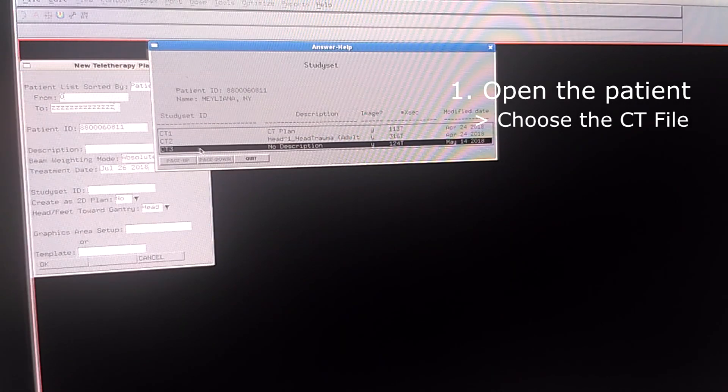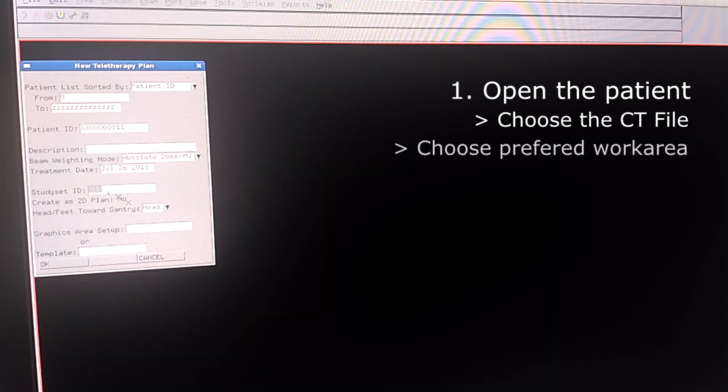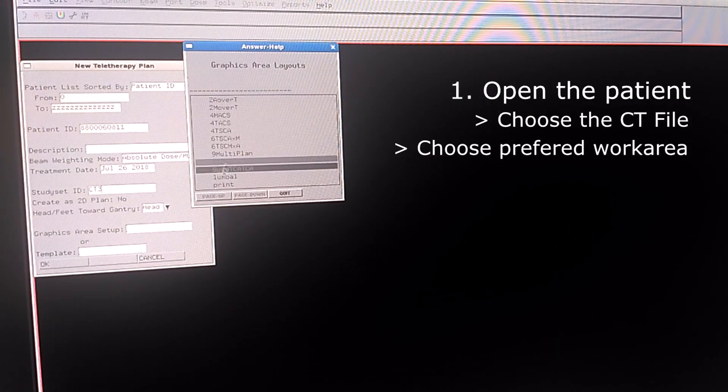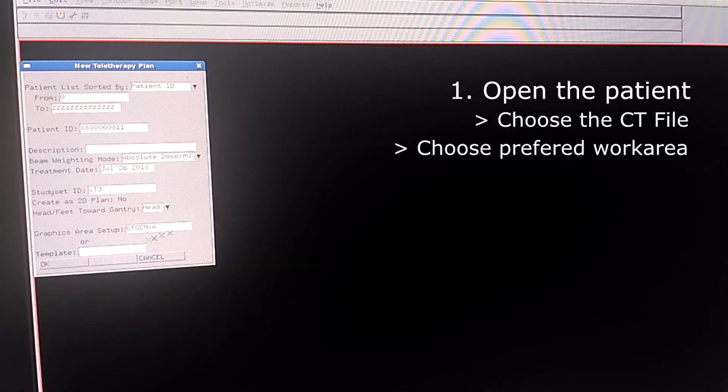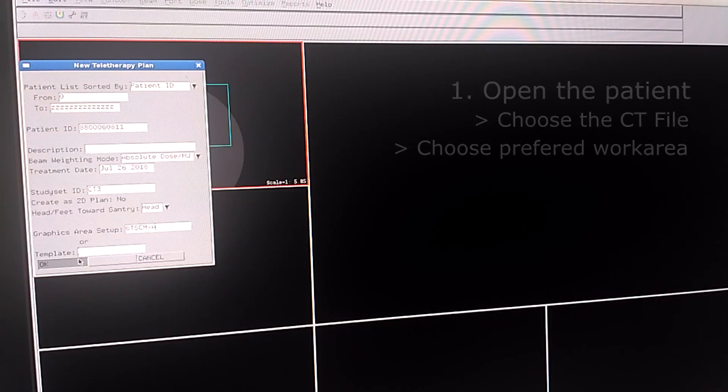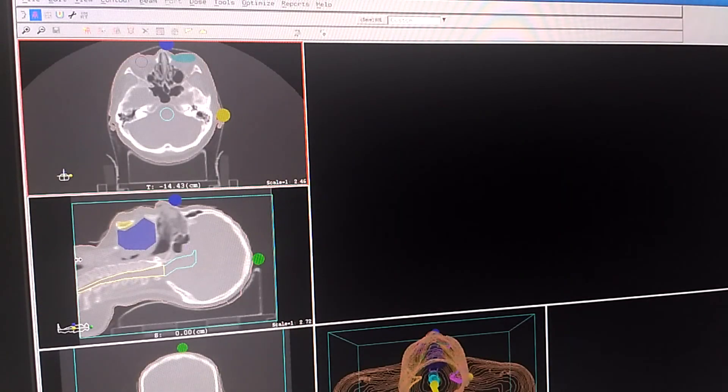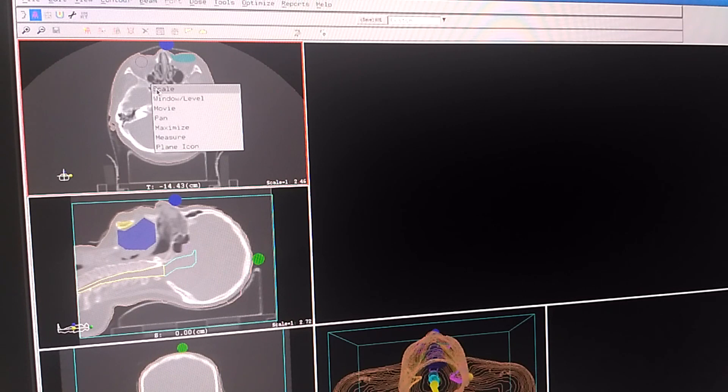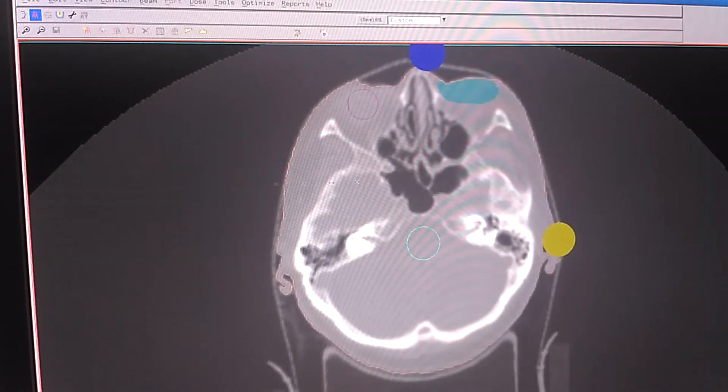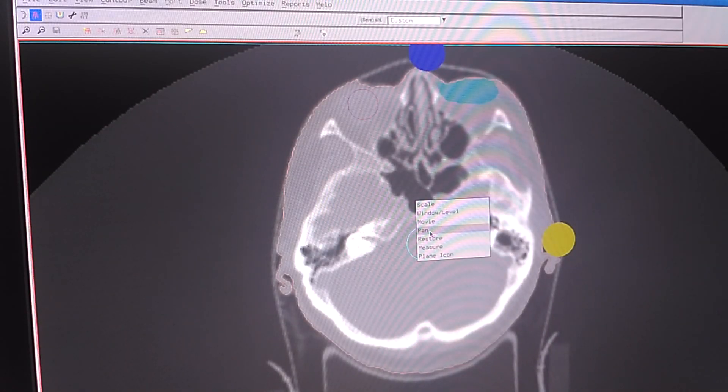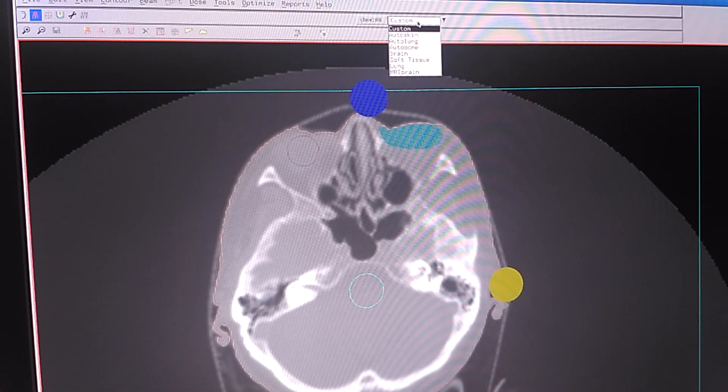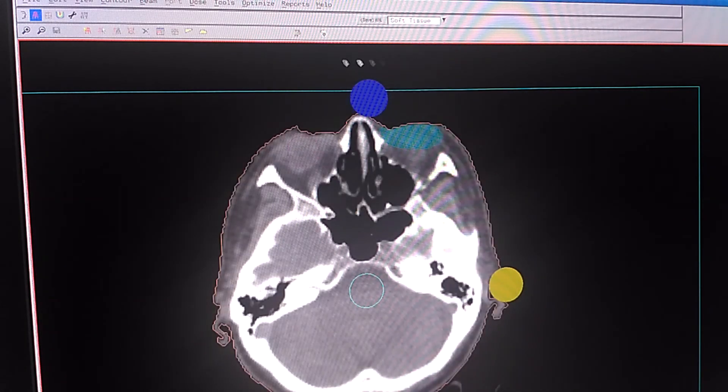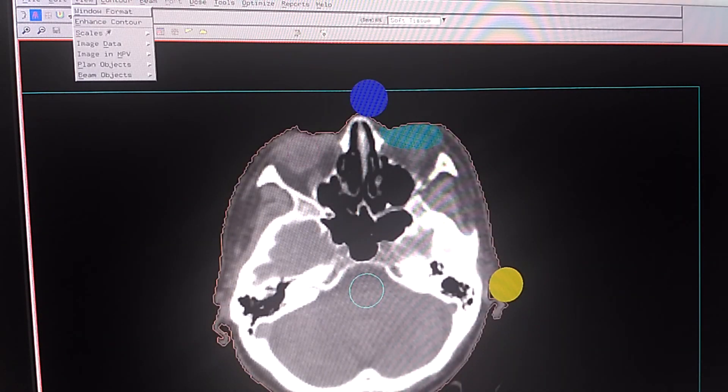And then we choose the CT and the graphic area setup which we like and click OK. Here we can see the patient. I am going to change the window level and turn off this plan object.